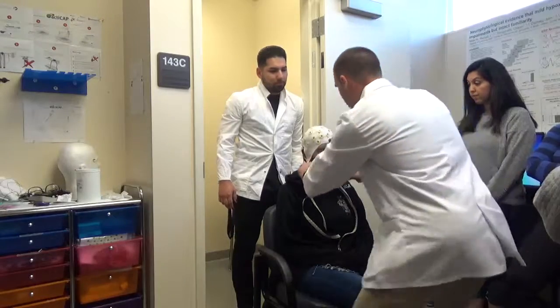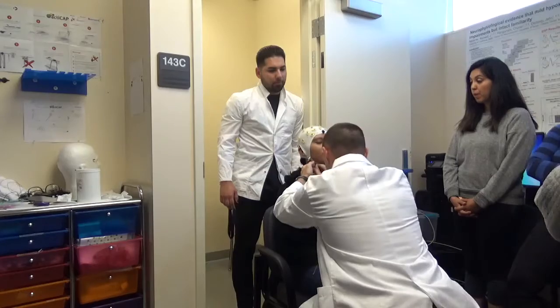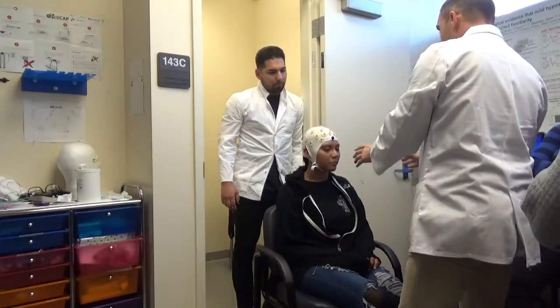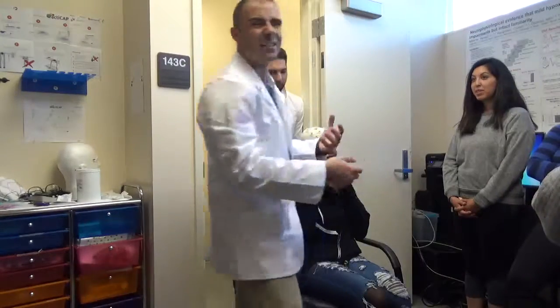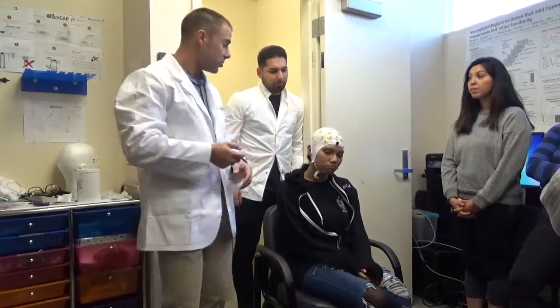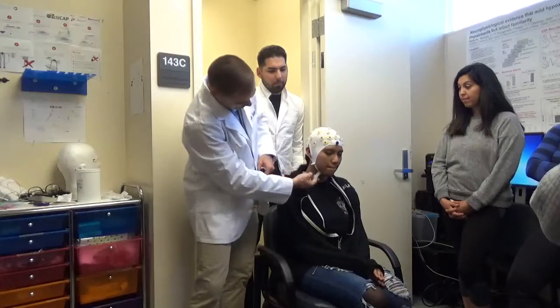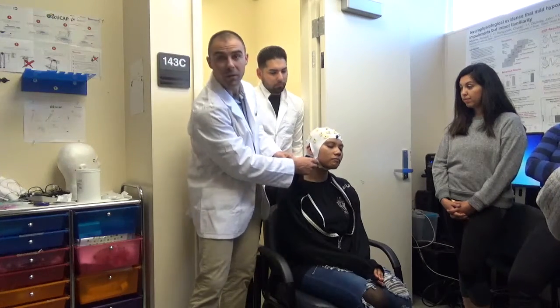And then you let them know that we'll Velcro this down, but that's an example of how we can put it on, and you can readjust that. It's a little too tight? Yeah. Okay. So you ask them to do that, because how do you really know, right? And you let them know this is going to be on for a while, so it should be comfortable and not too tight. And then sometimes they'll make it crisscross to the side, so you can bring it back.